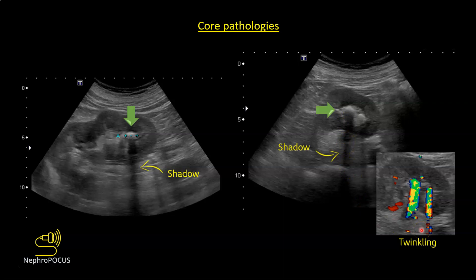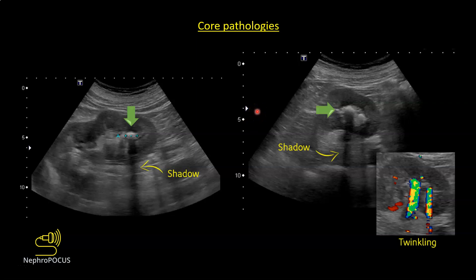On color Doppler, stones typically give an artifact called the twinkle artifact — the color Doppler mistakes a stone for turbulent flow, producing a mixture of colors wherever there are stones. Here you have one stone with shadowing, and another stone with shadowing, and on color Doppler you can see the mixture of colors following these two stones. The rougher the stone surface, the more pronounced the twinkle artifact. The twinkle artifact is better visualized if you place the focal zone at the stone or slightly below it. The focal zone is the area where the ultrasound beam is narrowest — like an hourglass sign on some machines — and here the arrow shows where the sonographer has set the focal zone at the level of the stone.